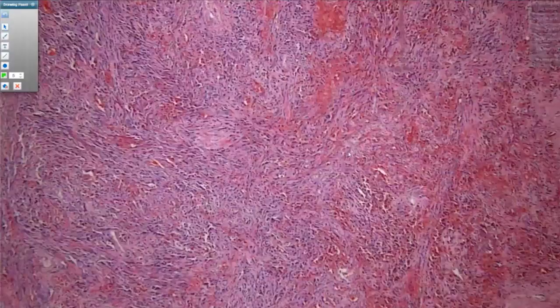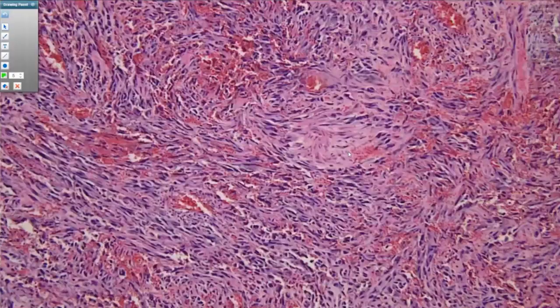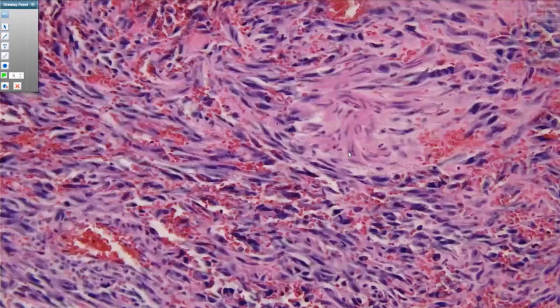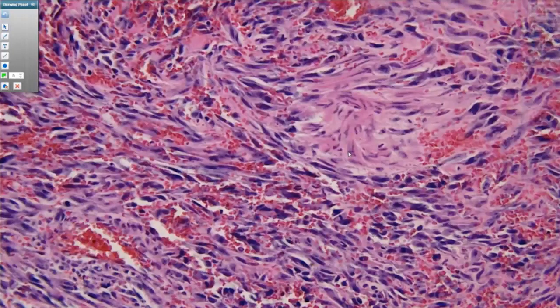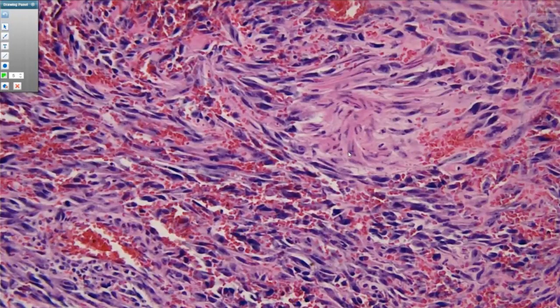And this is an example of a primary breast sarcoma, although in a way it's a secondary sarcoma in this case, as it's post radiation. As it's vascular, it will label for vascular markers, which include CD34, CD31, and ERG.